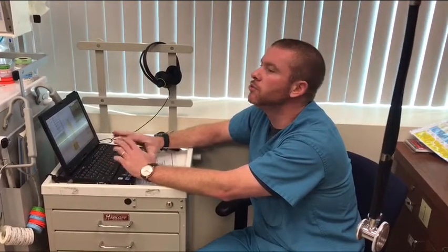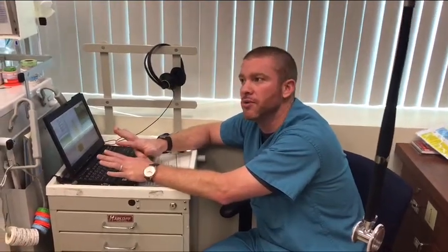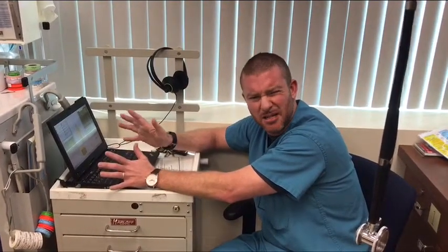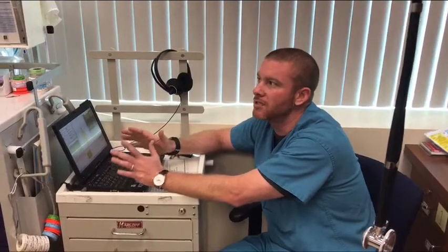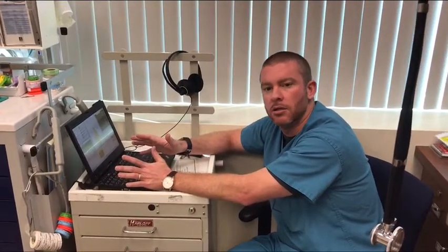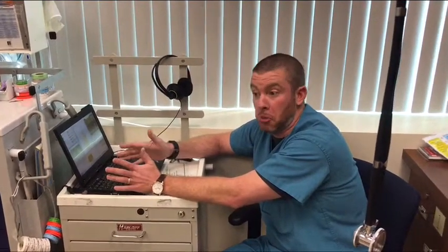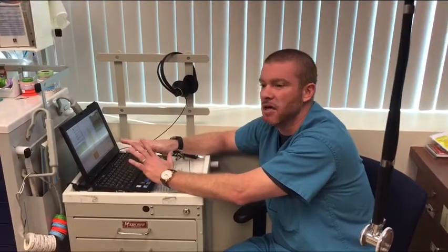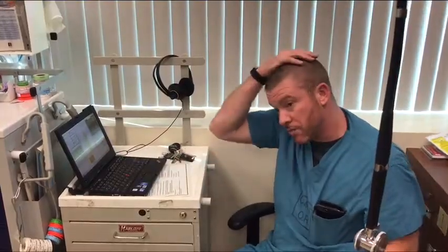Okay, my patient is bradycardic. This is good. I'm doing this for a reason. As soon as you see that, is that an emergency? It is. That's an emergency. And what's the cause of this emergency? Too much inflation, the pneumoperitoneum. So what do you tell them? Sir, drop the pneumo. Hey, turn the gas off. Evacuate the gas.